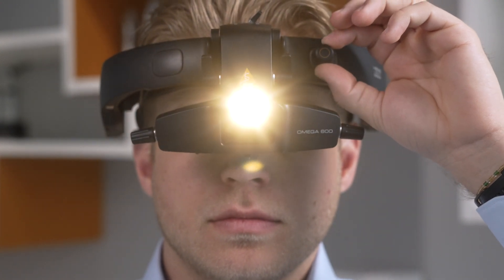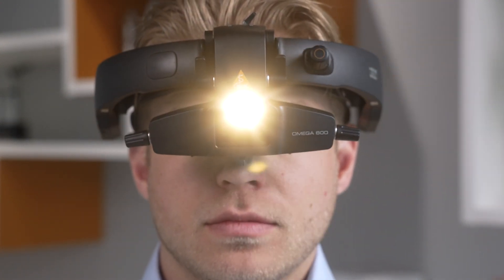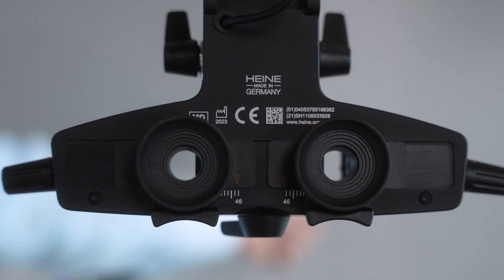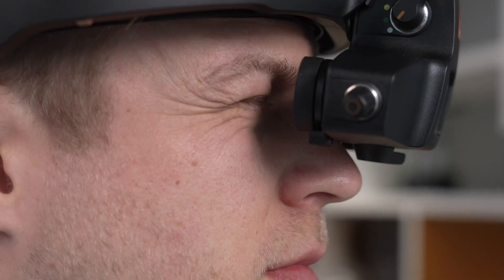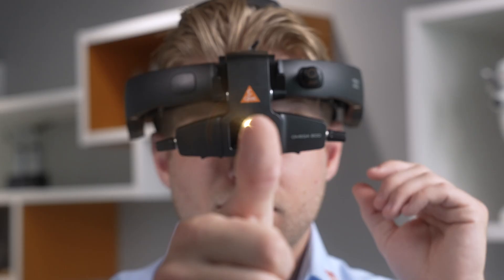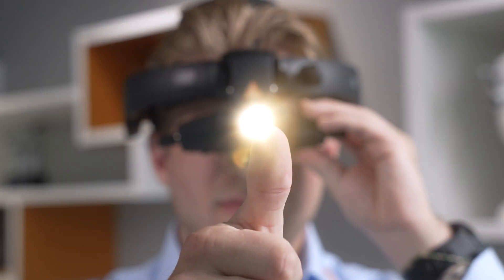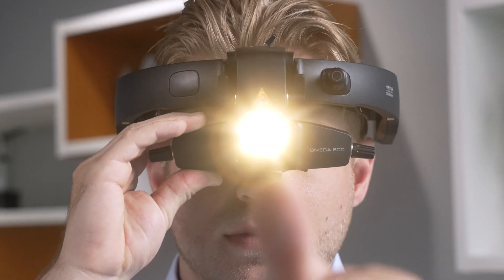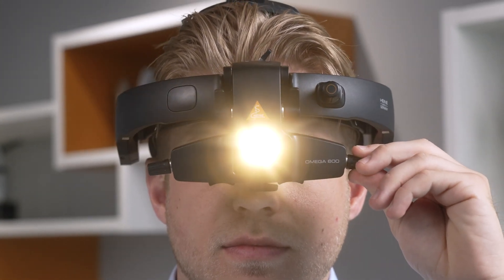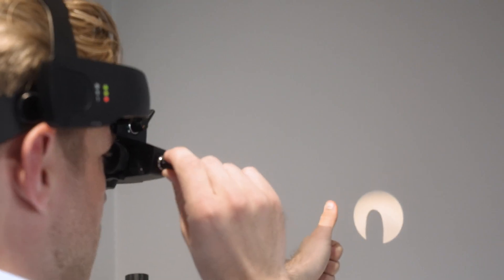We can leave the illumination at that first click for the time being. Now let's set the PD — here, we are aligning the eyepieces for your eyes. Hold your thumb out at arm's length directly in front of you. Close your left eye, and with your right eye open, adjust the right eyepiece until your thumb is centered in view. Switch eyes and do the same with the left eyepiece. Once your thumb is centered in both views, your PD is set. Now use the illumination height dial to center the light spot in your field of view.